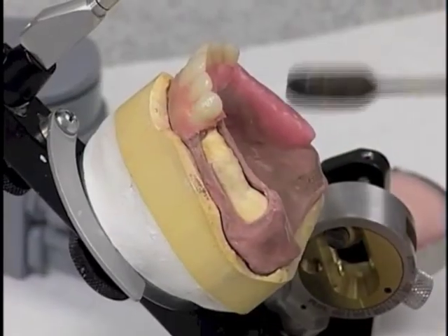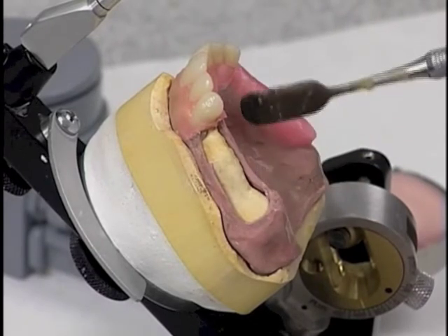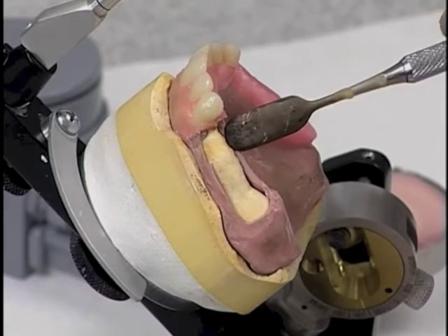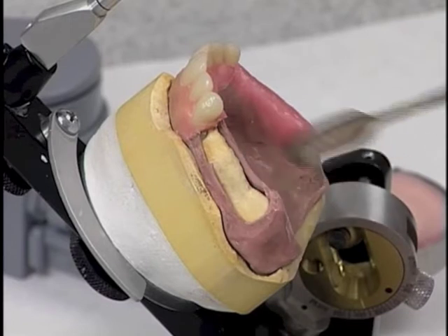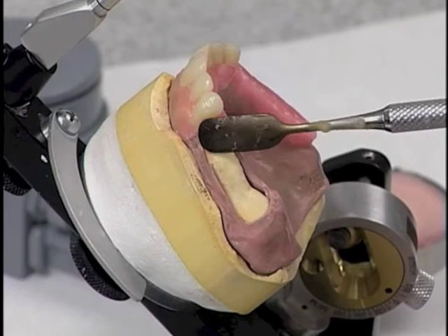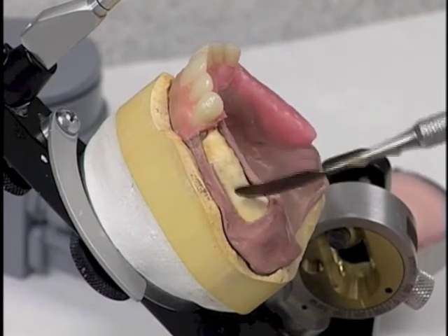If you must cut a window because you don't have enough space for the teeth, make sure the window is large enough. Cut it palatally, in this particular case, towards the palate, far enough to allow for all those lingual cusps on the posterior teeth. Cut it far enough up onto the buccal that you can accommodate the collars of the teeth without having to grind on the teeth, if at all possible.